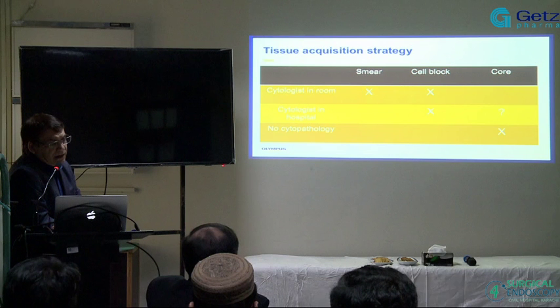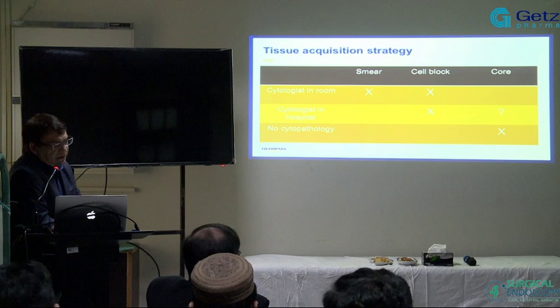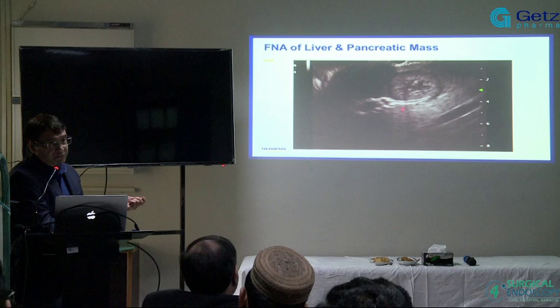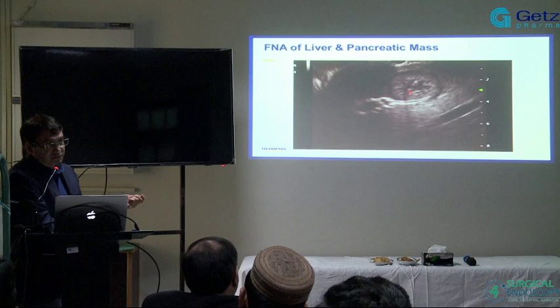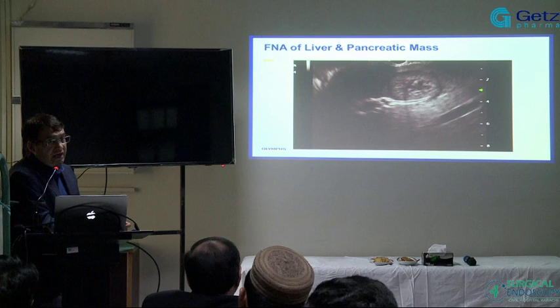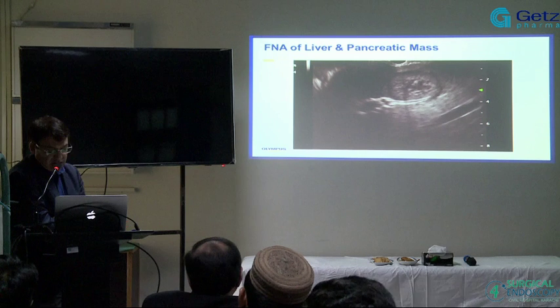If you have a cytologist or cytotech available, then a ring or target lesion there is very consistent with a metastatic lesion. And the majority of the time, you're not going to see metastatic lesions like that. They're really, really subtle, and you have to have an eye to look for that. And you have to be very careful.